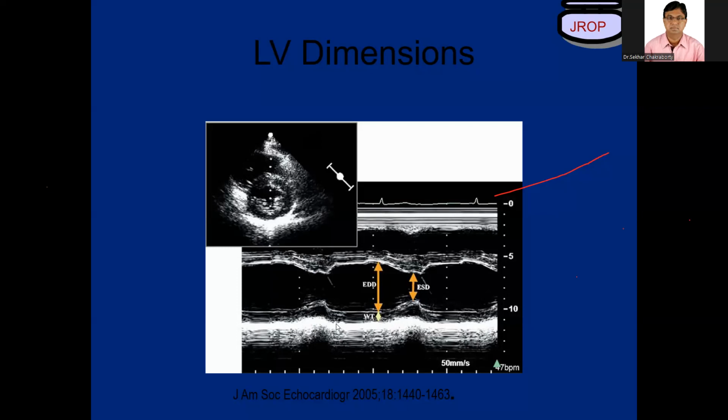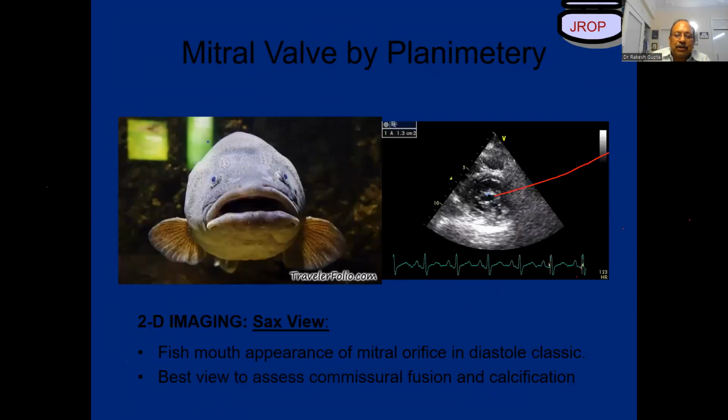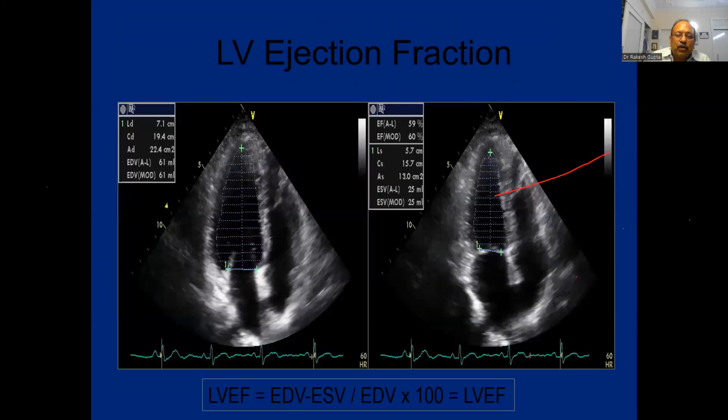Okay. Second is your LA volumes. Your question in calculating LA volumes is, where do we get that?